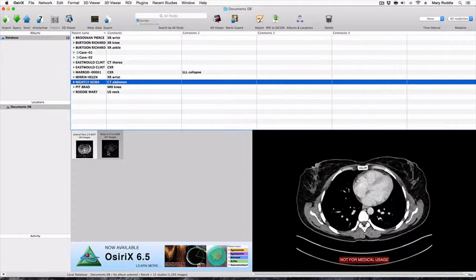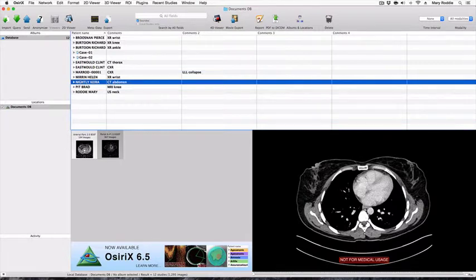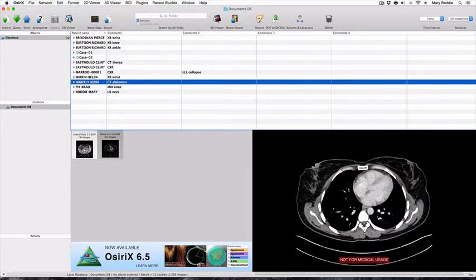The portal phase study has 367 images which is probably too many for a teaching or examining set, so we're now going to revise how to reduce the numbers.